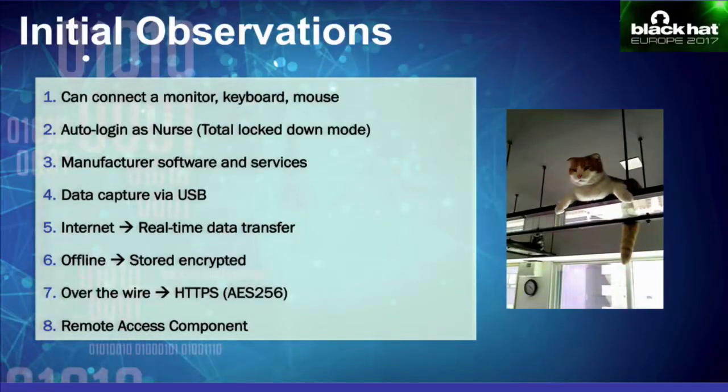The data is transferred to the pharmacy systems using SSL. So that part was secure. And then there's a remote access component to it as well.